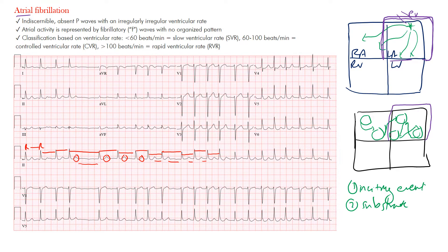We call that an irregularly irregular rhythm, and atrial fibrillation is the most common irregularly irregular rhythm. Causes include congenital heart disease, cardiomyopathy, any form of toxicity, rheumatic heart disease affecting the mitral valve, a familial form, drugs, inhalants, and ischemia. If you see atrial activity, you tend to see small fibrillatory F-waves with no organized pattern. Here we don't see much of it — maybe slightly in lead three — and it almost looks isoelectric.